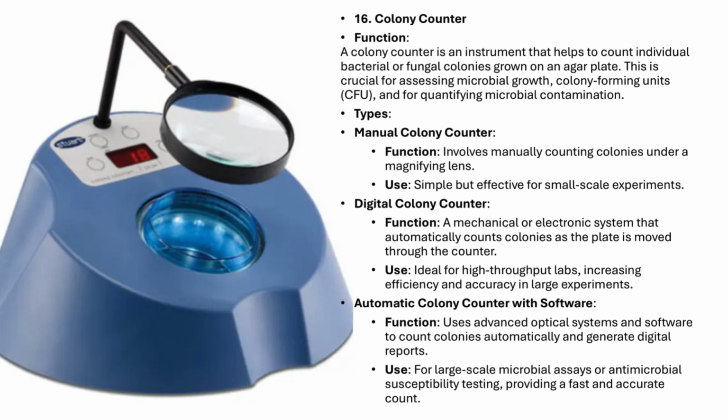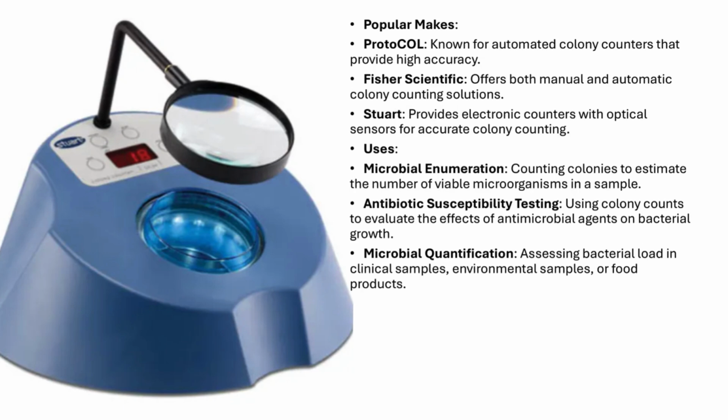Popular makes. Some well-known brands that offer colony counters include Protocol, known for their automated systems, Fisher Scientific, which offers both manual and automatic options, and Stuart, which provides electronic counters with optical sensors for accurate colony counting.